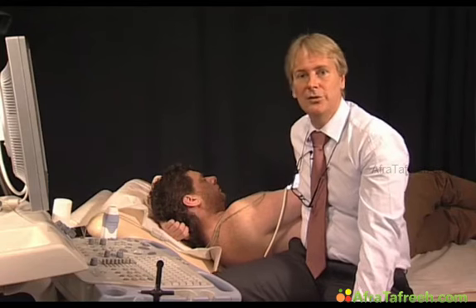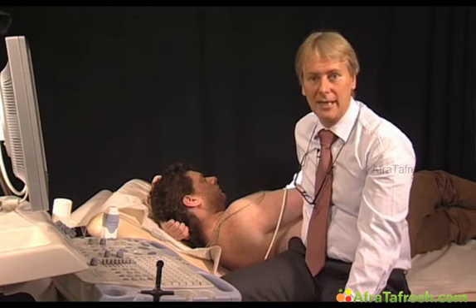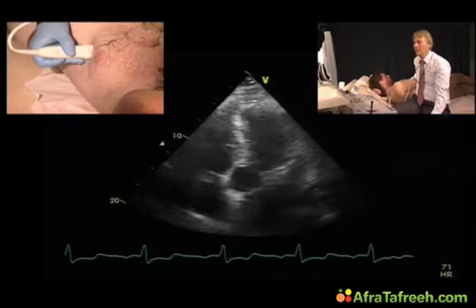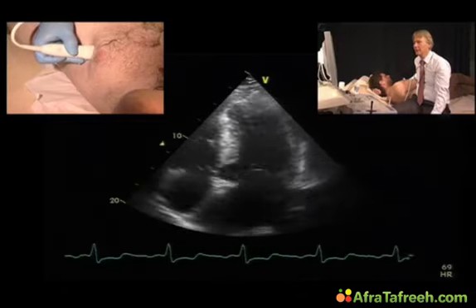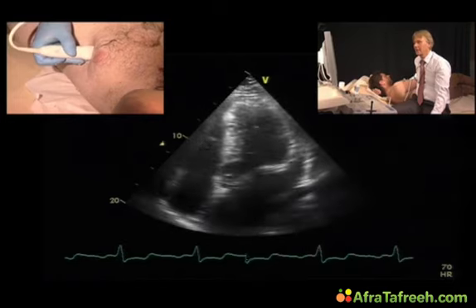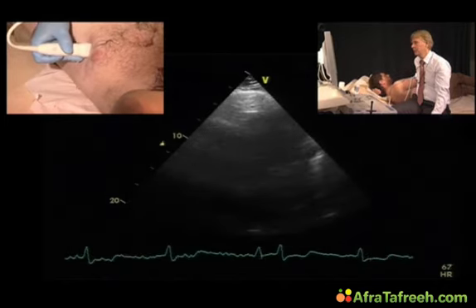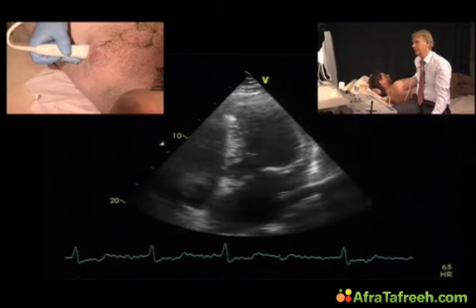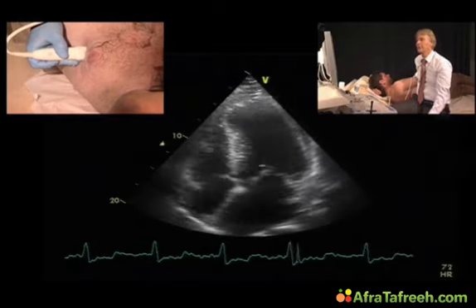It's also important to look at the gradients under provocation. We can perform a Valsalva maneuver, or we can also give the patient nitroglycerin. The problem is that with the provocation maneuver, we usually change the heart axis. So this is the 5-chamber view. And you see we partially lose the image, and that makes it very difficult to sometimes get those gradients. So you have to often perform this maneuver several times.